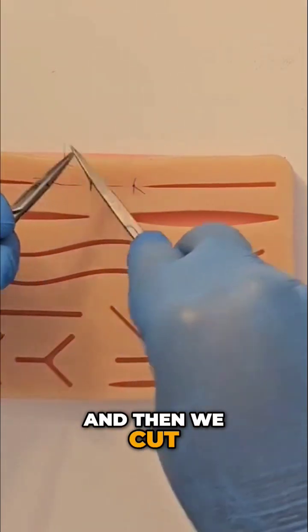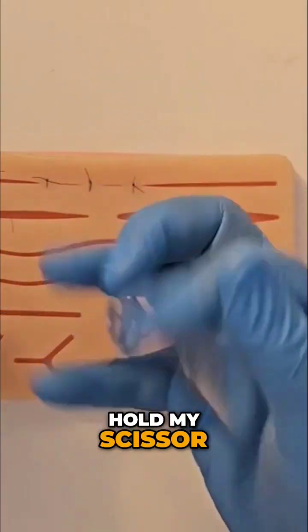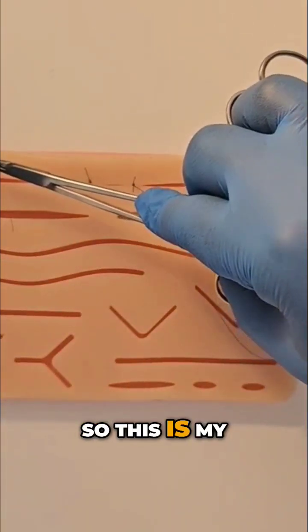And then we cut. I'm doing lots of cutting — I like to flip my scissor. And we do one more of the interrupted, so this is my first.